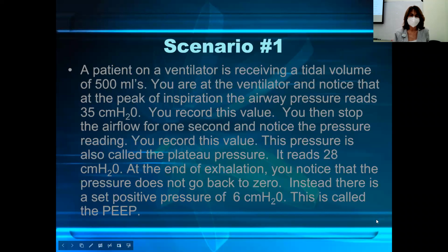There's the scenario. So calculate dynamic compliance and static compliance.